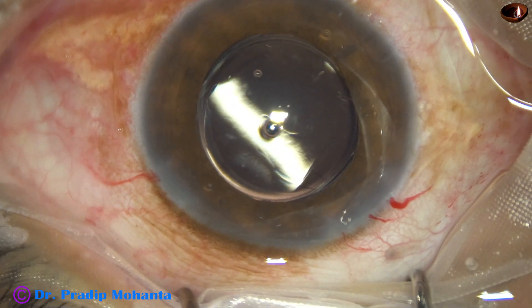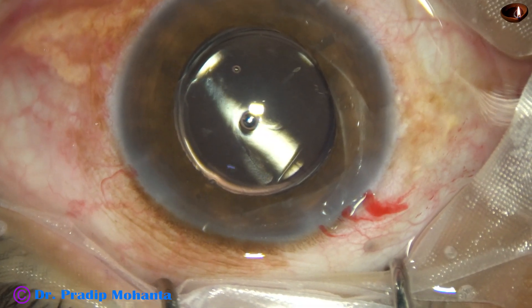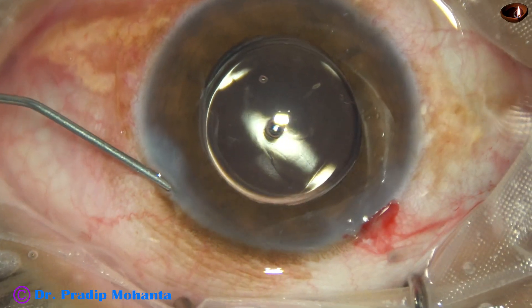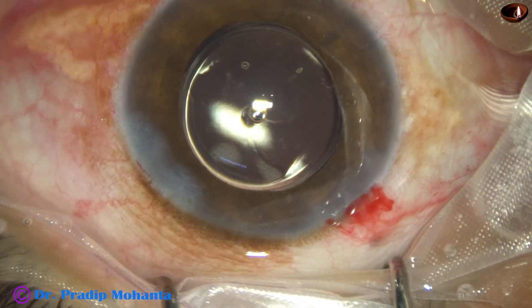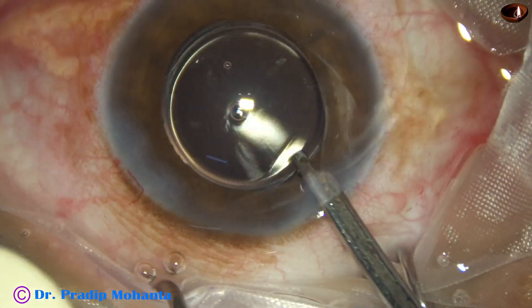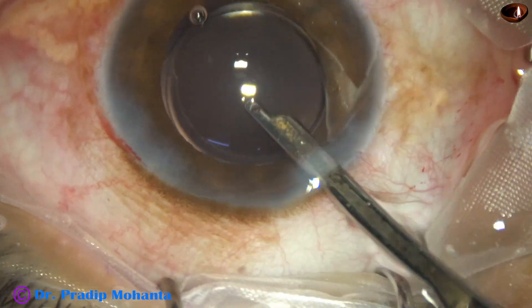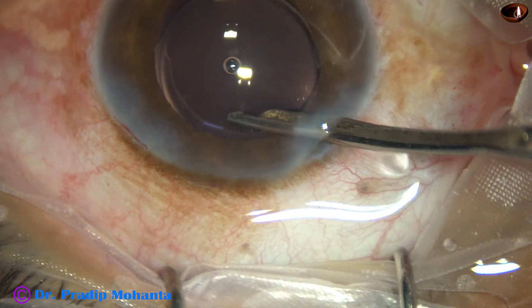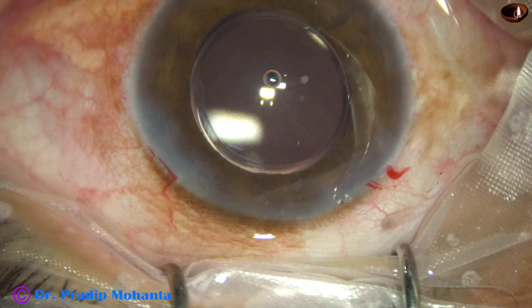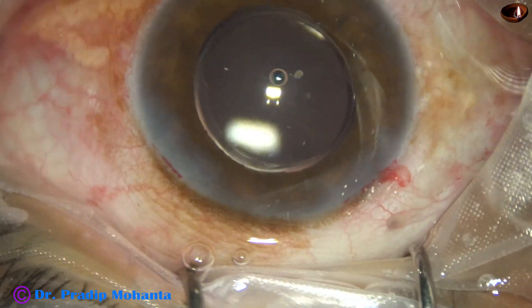A bit of moxifloxacin is injected into the anterior chamber. Then the side port is closed by stromal hydration. I do a final lavage of the anterior chamber, and with this technique the incidence of endophthalmitis is negligible in my surgeries. The integrity of the wounds is checked. A few drops of moxifloxacin are applied over the ocular surface and the case is concluded.